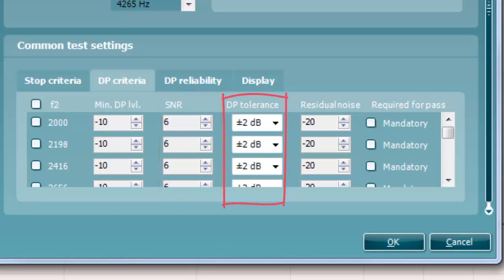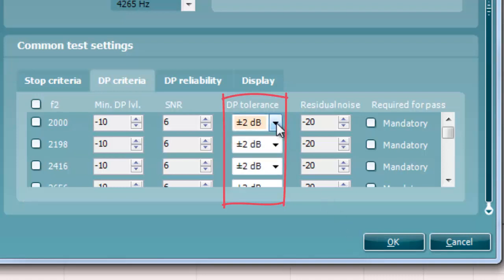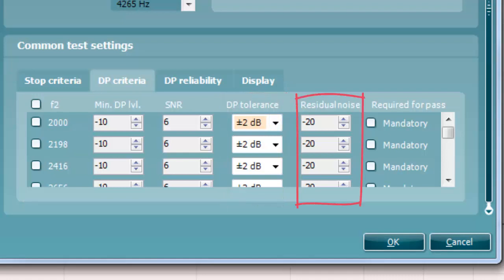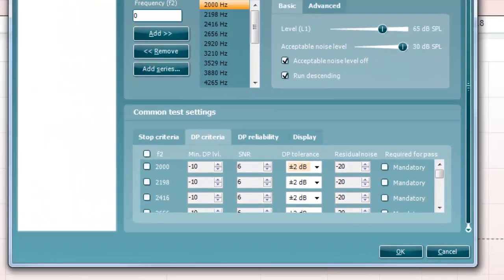DP tolerance defines how stable the OAE must be over time in order for it to meet the stop criteria. Residual noise allows you to define at which level the residual noise is considered to be so silent that a DP OAE would have been detected if it were present.